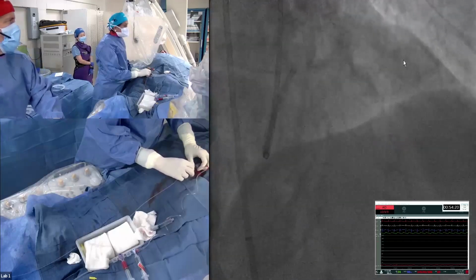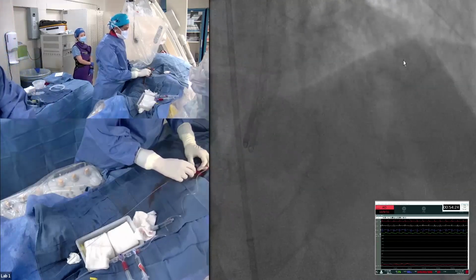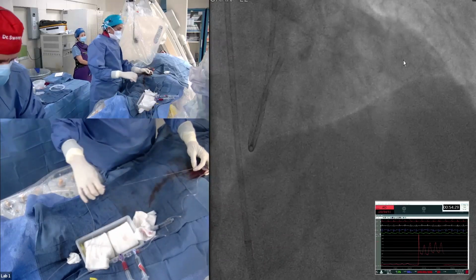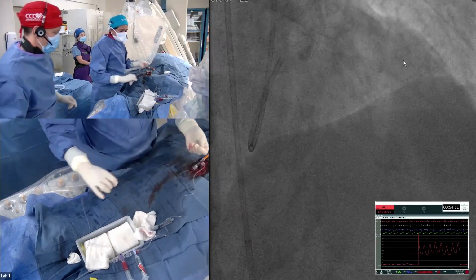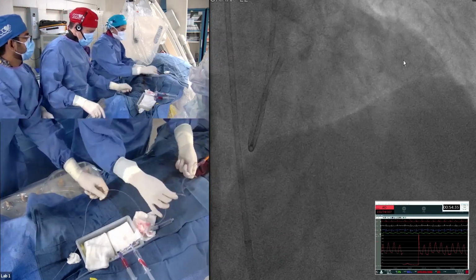I like bigger burrs too, and I'm certain she's going to have to go a little bit bigger. So the question would be if she's going to escalate now to 1.5. Yeah, that's right. Or you do the whole procedure with that one burr. For the discussion, let's take a picture quickly and see what we have created. Picture, ready?